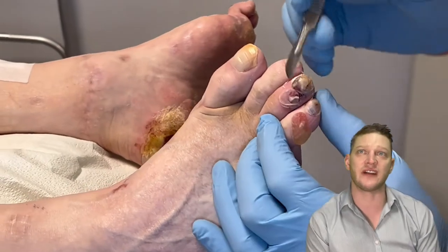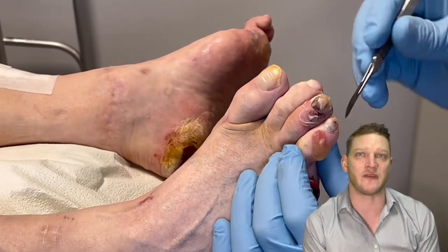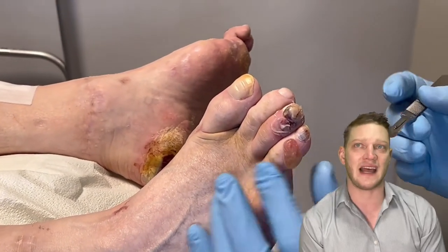All right, so here we go — I'm pushing it out. There it is. I'm leaving that roof intact. That roof being intact is important.